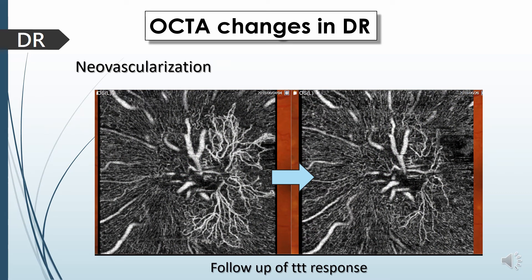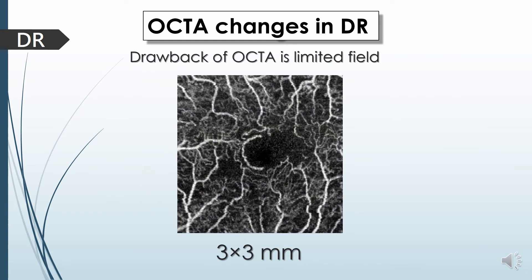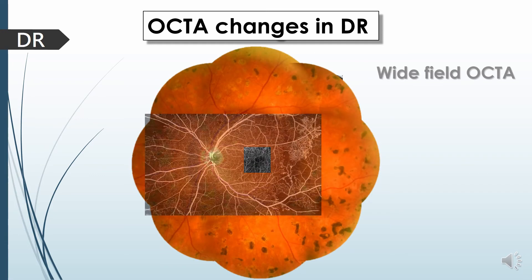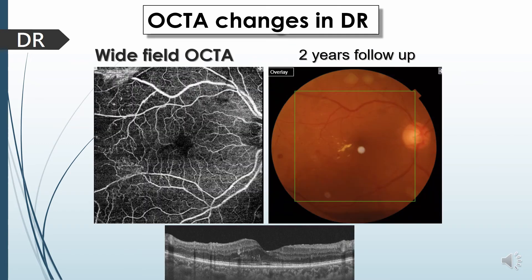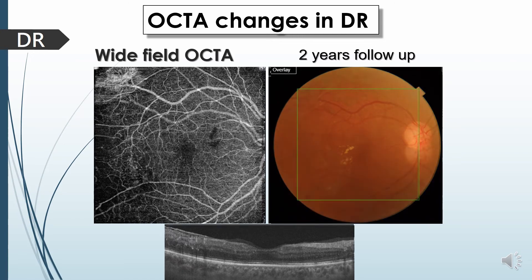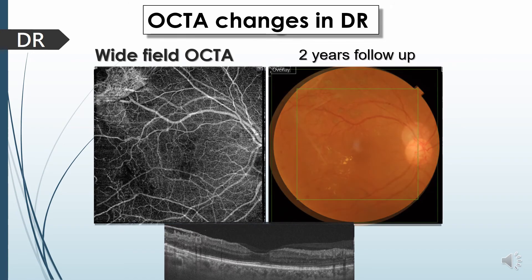One of the main drawbacks of OCT angiography is the limited field of evaluation; however, with the evolution of this technology and wide-field OCT-A imaging using 12x12 scans, we can combine these images and evaluate the retina up to the mid-periphery. We can repeat OCT imaging safely to follow up PDR patients, detecting ischemic changes involving the temporal macula, the foveal avascular zone, and the involution of neovascular tufts replaced by fibrous tractional membrane.